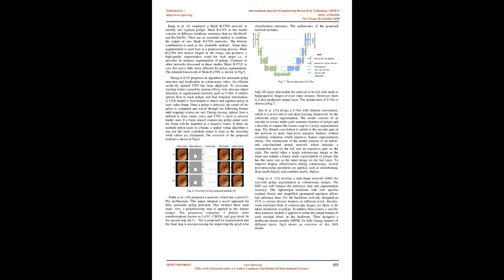In the FP learning scheme, the detector system is post-trained with automatically selected negative detection outputs, FPs, which are detected from normal colonoscopy videos. This is effective to reduce many of the polyp-like false positives. The offline scheme further improved the detection performance by using the video-specific reliable polyp detection and post-training procedure. Fig.4 shows an example of polyp augmentation.